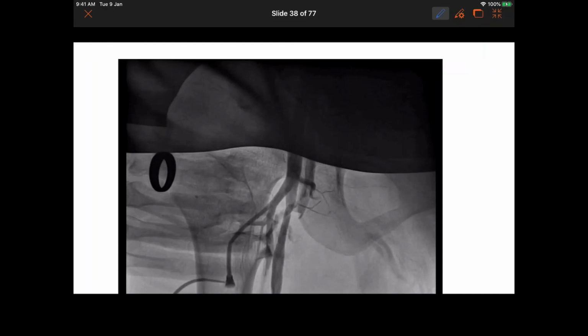BMV, you know, is a very challenging procedure. The procedure was done very meticulously and without any complications. And this was a 5 months pregnant lady. You can see the protective lead shield over the abdomen to protect the baby inside.